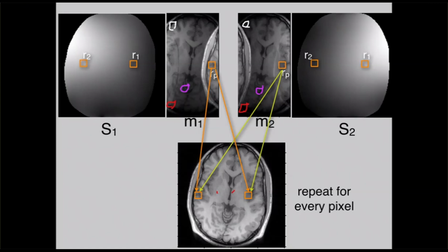And that is often solved iteratively, in an iterative fashion, because it's just not possible to perform these inversions. But for the simple case, where you undersample uniformly, factor of 2, factor of 3, then it's really just solving inversions of 3 by 3 matrices, 2 by 2 matrices, very small, but many, many times. Okay, pretty cool, right?